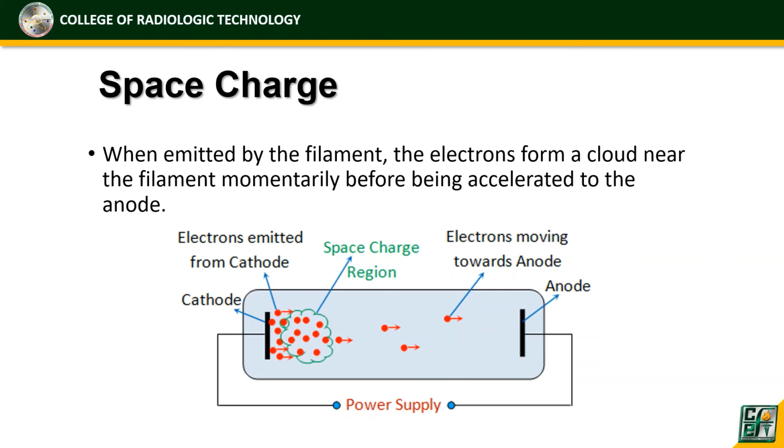So these electron clouds are gathering in the cathode side and are not propelling towards the anode side, thus bringing forth the effect we call the space charge effect. Dahil sa space charge effect, na-develop yung tinatawag nating focusing cup. So ano bang kinalaman nito sa tube current at filament current? So later let us see.